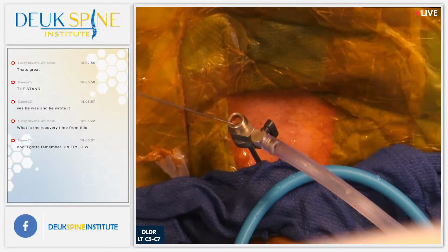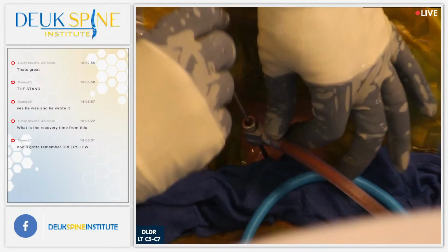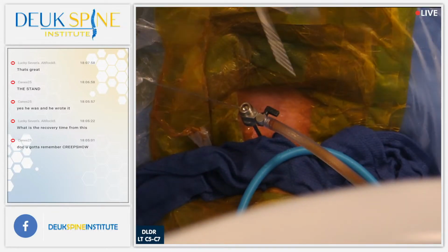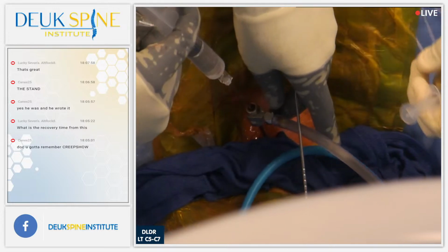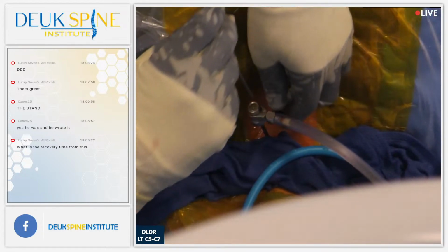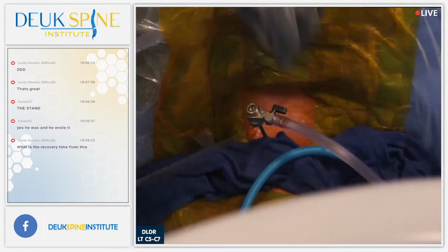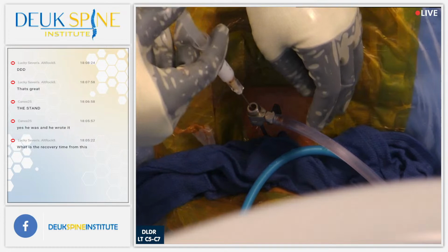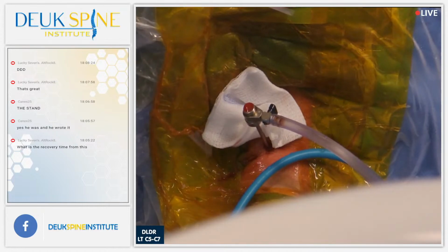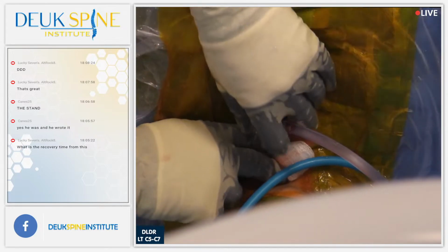I'm going to show you guys this incision. It's tiny. First, a little antiseptic. I tell people we used to use, in all of our surgeries as surgeons, neurosurgeons, we always clean the wound when we're done with sterile saline. If any bacteria happen to find their way down there, it gives the patient a better chance of clearing it out without getting an infection. So we've always done these irrigations at the end of surgery.